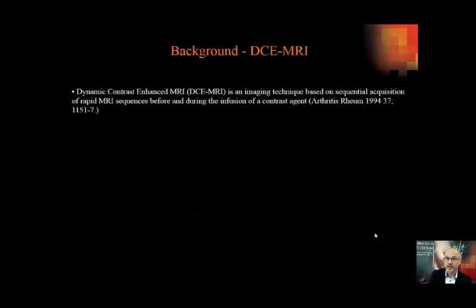The background of dynamic contrast enhanced MRI, which is not a new technique, it was actually evolved and used a lot in the 1990s, is that it's based on this sequential acquisition of rapid MRI sequences before and during the infusion of a contrast agent.